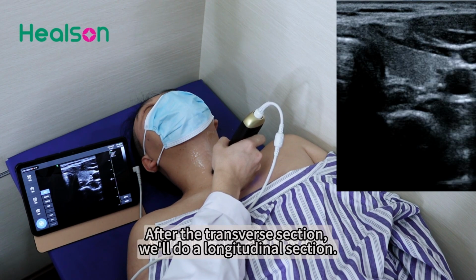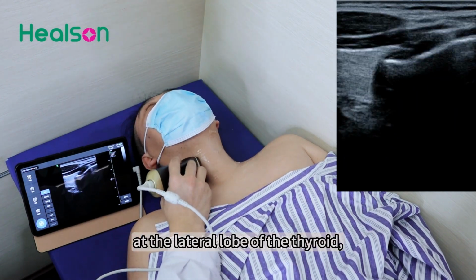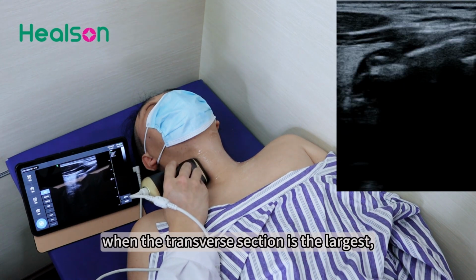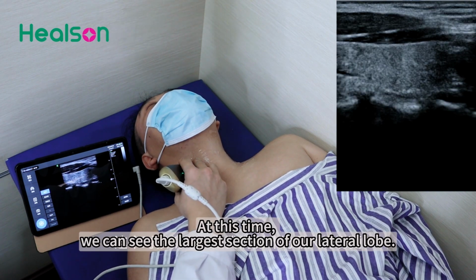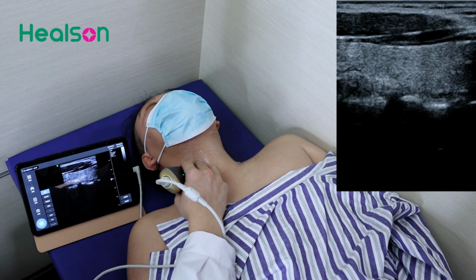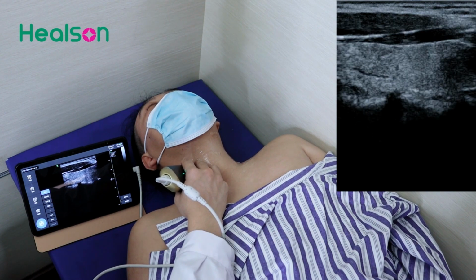After the transverse section, we'll do a longitudinal section. In the longitudinal section, at the lateral lobe of the thyroid, when the transverse section is the largest, rotate the probe clockwise. At this time, we can see the largest section of our lateral lobe. It is also in the longitudinal section that we measure the thickness of the lateral lobe of the thyroid.